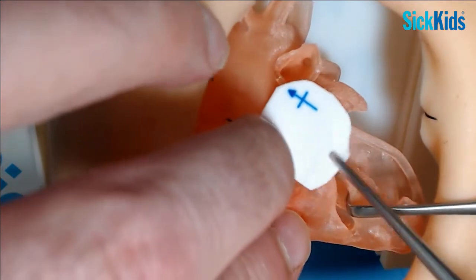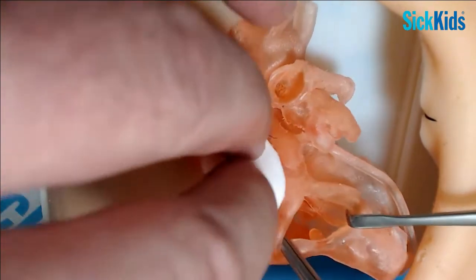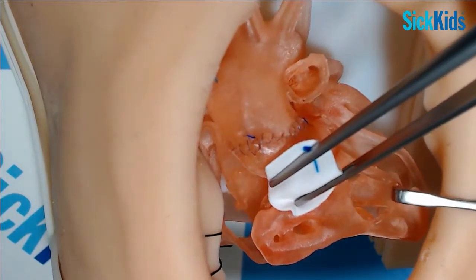And so I've tended to always do things with interrupted sutures, so I feel it's a bit safer, but today we'll do it with continuous, for the sake of speed.